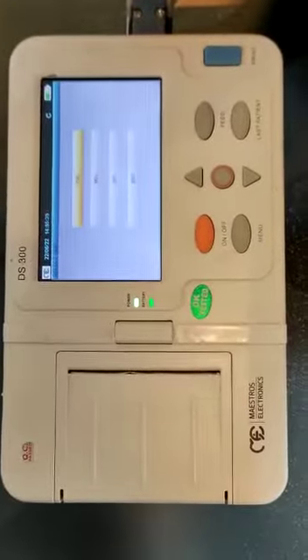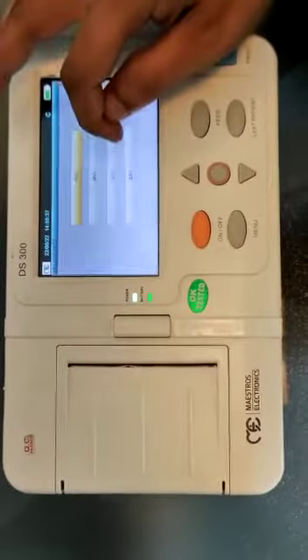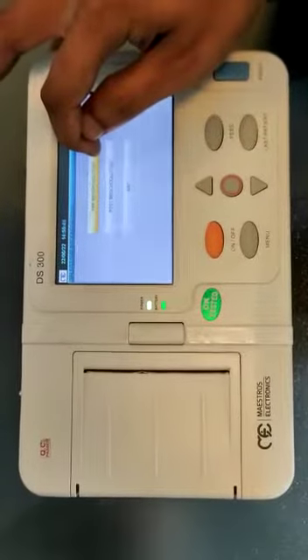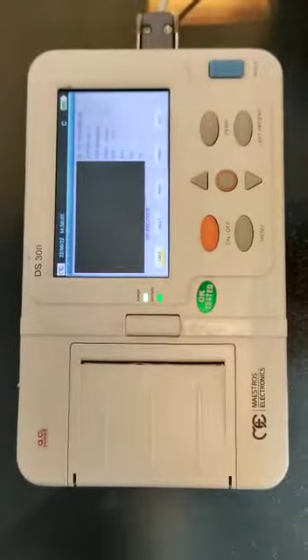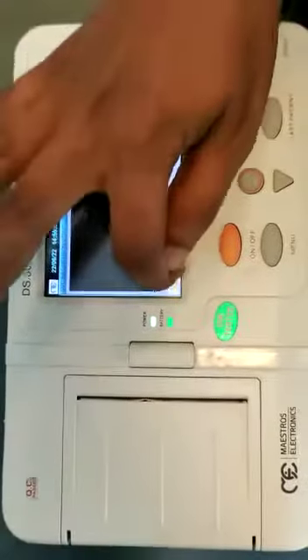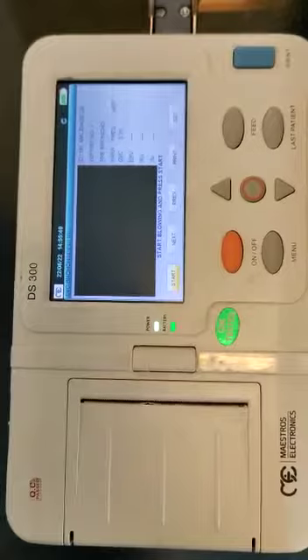Now let us perform the third test, which is SVC. Pre and post — select pre. The screen is as shown. Click on take and then start.